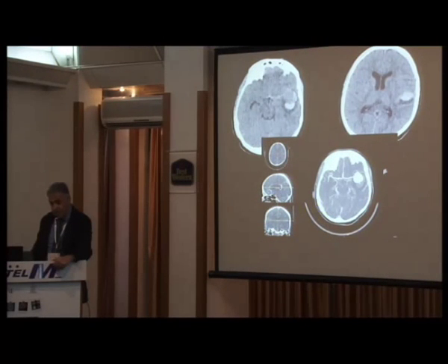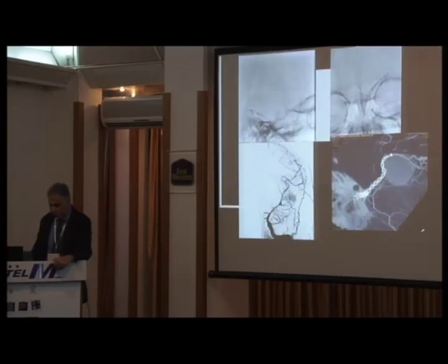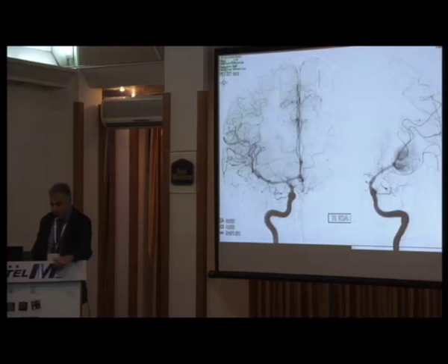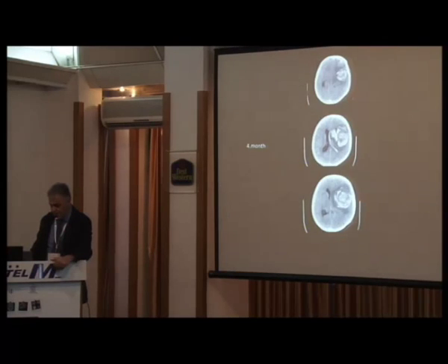Another one, a ruptured MCA aneurysm. We were lucky because we are starting to get success. Look at the aneurysm itself. How can you treat this one? It is hard to understand where the upper truncus originates from. We found it, and we did the flow diverter treatment. This is immediately after, and this is immediately after, and this is 4 months or second month later. Look at that. The aneurysm started to thrombose with a serpentine type of lumen reaching the distal part. Oh, so good. Now we're reaching our goal. Is it? This is the 4th month. Ruptured and died.